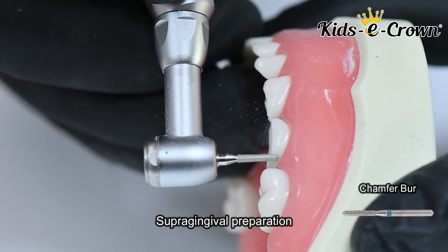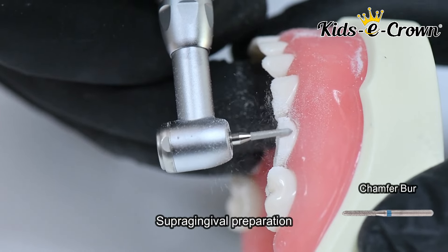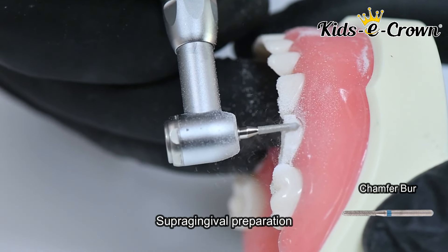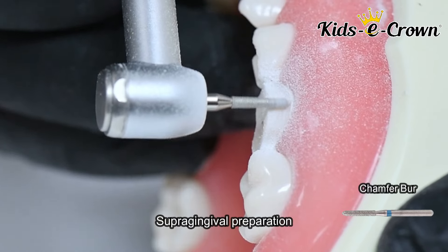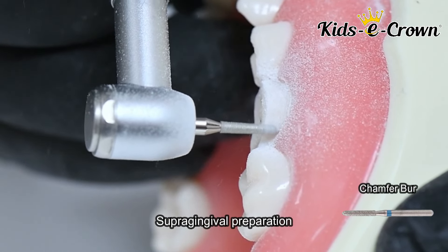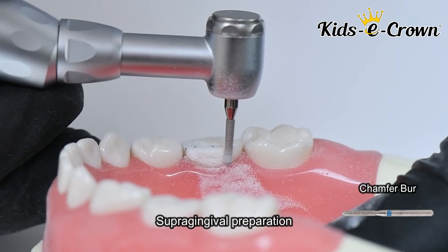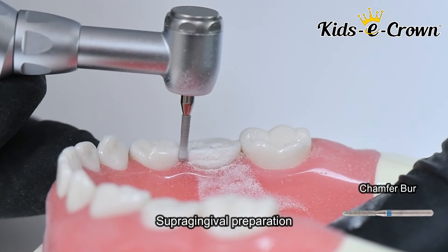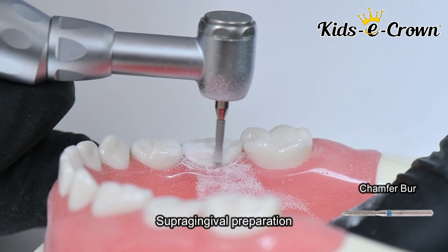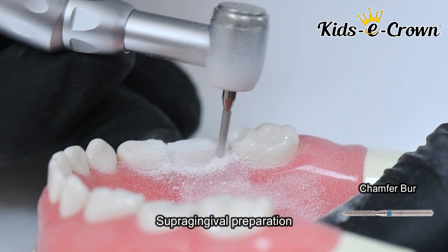Step 2 is a chamfer preparation, or a margin line supra-gingival preparation, using a chamfer burr. You create a margin which is 1 mm in thickness on all 4 sides of the tooth — on the buccal surface, the lingual surface, and the interproximal surfaces — using a chamfer burr.